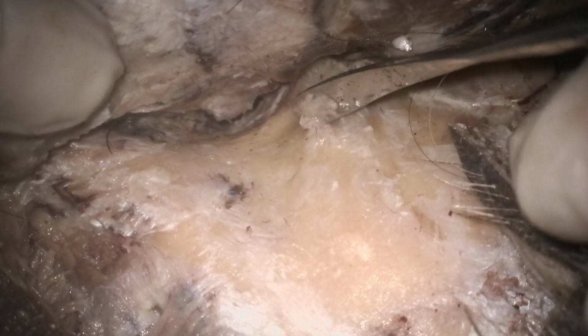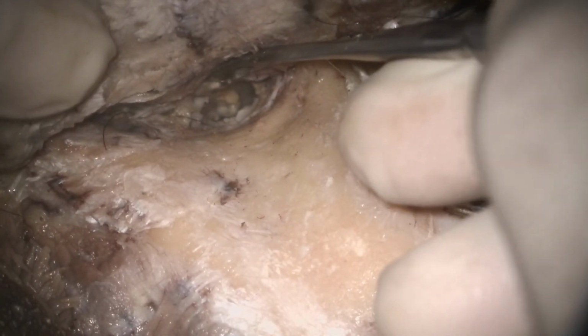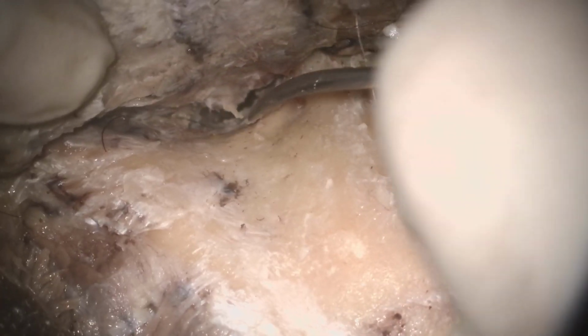So now just behind the external auditory canal, in the posterior canal wall, you will have a notch, and this is the spine of Henle. Depending on the anatomy, in some patients this is very prominent, and in some patients it will be very rudimentary, but in any case you will find a notch over there, and that is the spine of Henle. This is a very important landmark for every dissection for the otologist, because it directs the actual canal and it will show where you have to go for the cortical mastoidectomy.